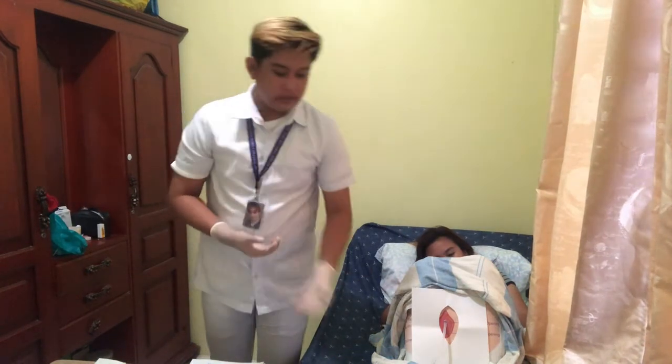Okay, so now if a specimen is to be collected, we'll have to pinch the catheter with the thumb and our finger while placing the specimen container in position. After inserting and pinching, we'll rest our hand on the pubic area while holding the catheter in place to prevent pulling and pushing the catheter. Pulling and pushing of the catheter can promote entry of microorganisms which may cause infection. After that, we'll now connect the catheter to the urine bag.